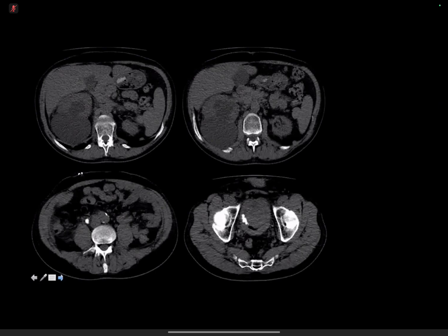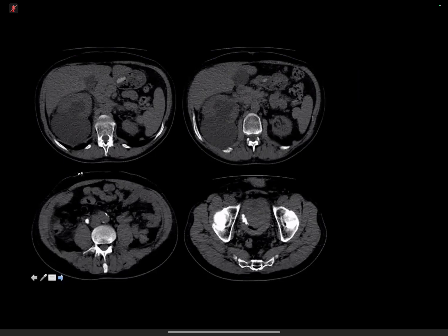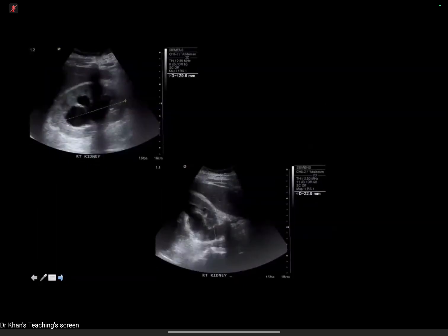I think that one thing that I can see is for nephrostomies, you want to go to the posterior calyx of the mid-pole, ideally. And I can see there's this cystic lesion sitting there. Good. And then we are unsure whether this is just simple, it doesn't look like entirely a simple cyst, so we're unsure of the nature of this. So we could do an ultrasound and just first characterize what this is. Okay. But the path of the nephrostomy that I'd ideally want, this would hinder it.